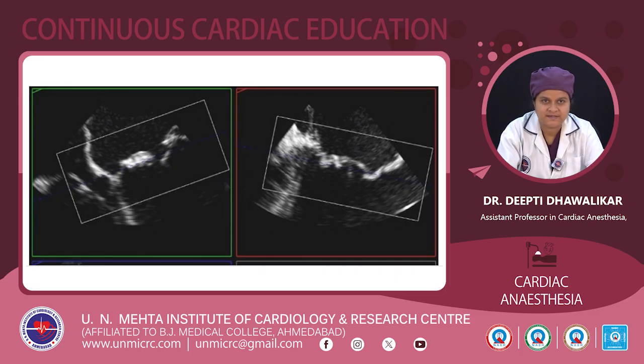So this is a picture showing mitral valve with thickened valve leaflets which are prolapsing, and there is failure of coaptation of the leaflets, which will give rise to MR.